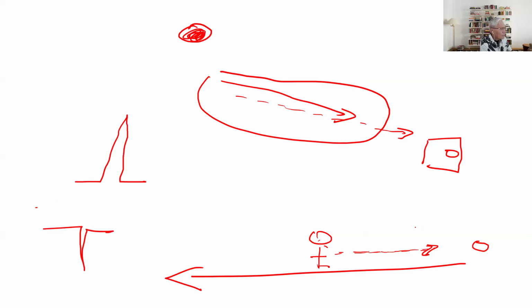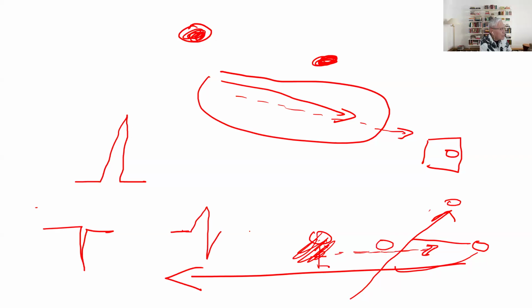Now, let's say that your friend, instead of going away, is going to go like this. So in the beginning, the friend is going to be big, and then it's going to be small, isn't it? Because it's going away from your camera. So it results in here in an electrocardiogram. If we're viewing it from here, then it's going to be something like this, okay? So that explains why this is a common question.